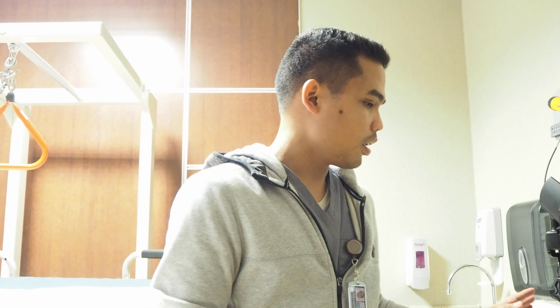And then once everything is done, we position the patient back to their original position, make sure they are comfortable, and then every time we're done doing the therapy, we do vital signs, assess, and make sure we auscultate to see if there is any improvement. And then before going out, remove PPE, wash our hands, and chart everything we observed of the patient. And if the physician is present, make sure we communicate it with them, and even the nurse in charge.